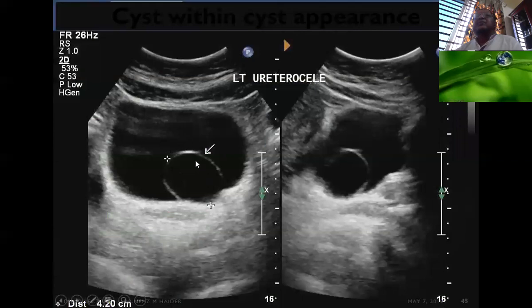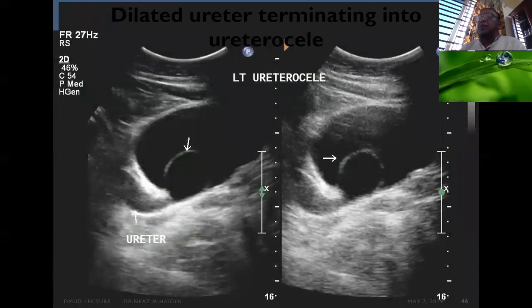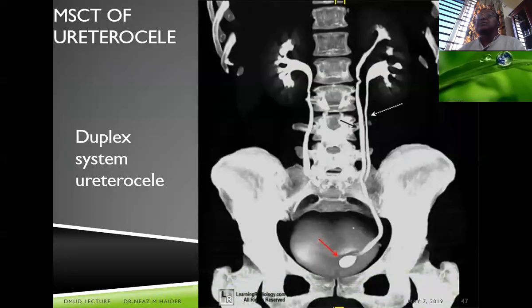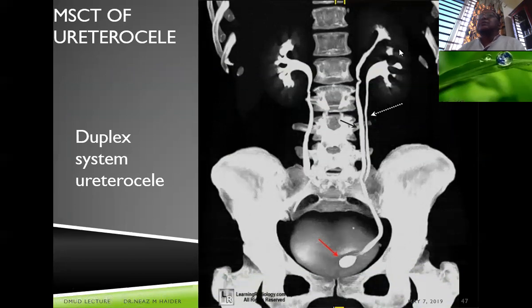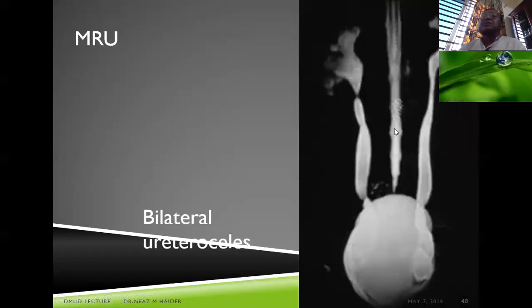The cobra head sign is again demonstrated on IVP. A duplex system ureterocele of the urinary bladder is shown alongside a normal kidney and ureter. A bilateral ureterocele with a single collecting system is also illustrated.